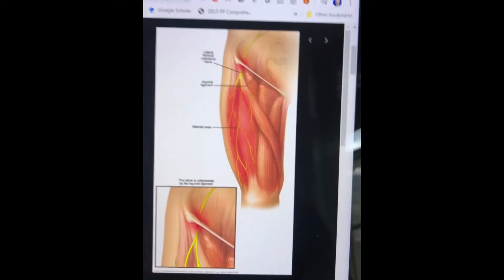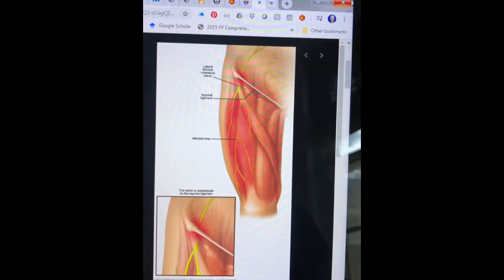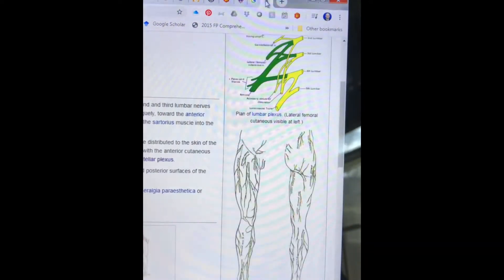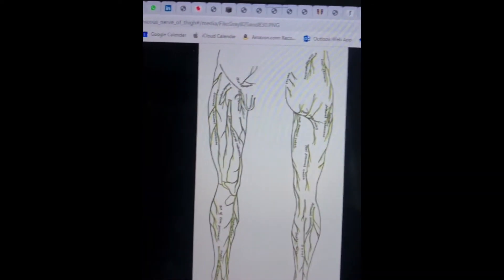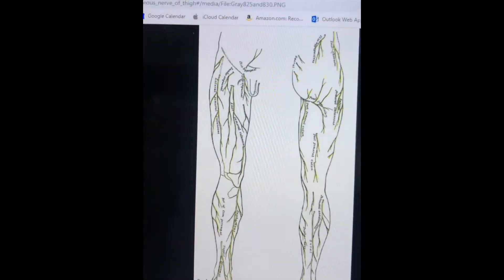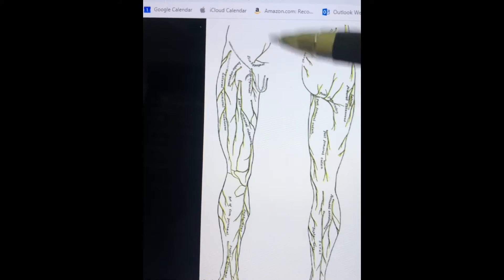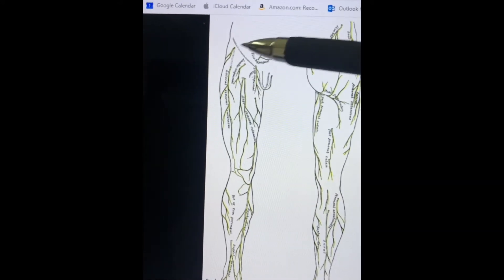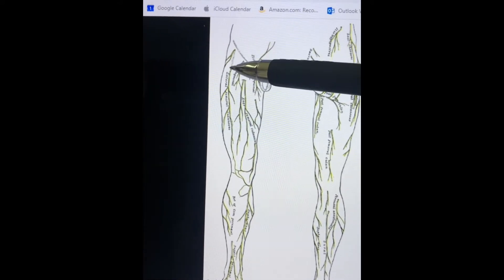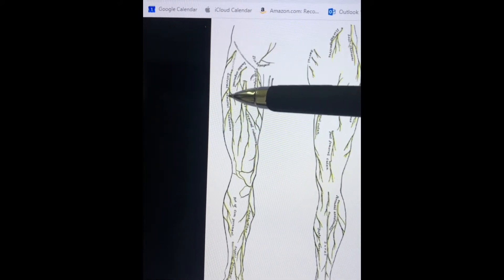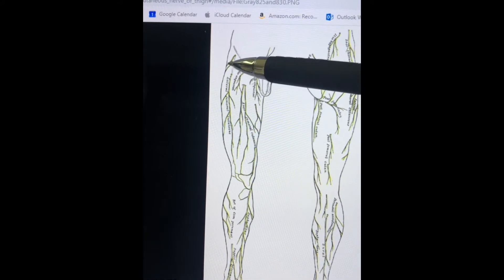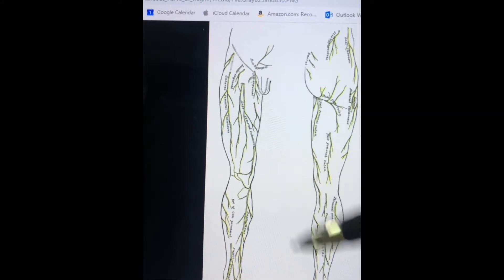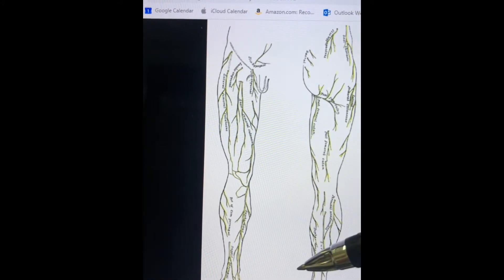What's also interesting is that the lateral femoral cutaneous actually divides into three branches, as demonstrated here. There is the anterior branch, and then a posterior division which itself divides into an intermediate and posterior branch.